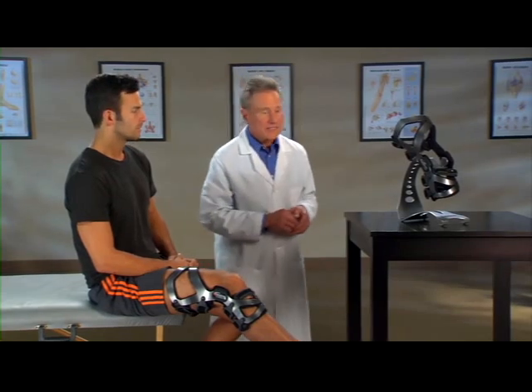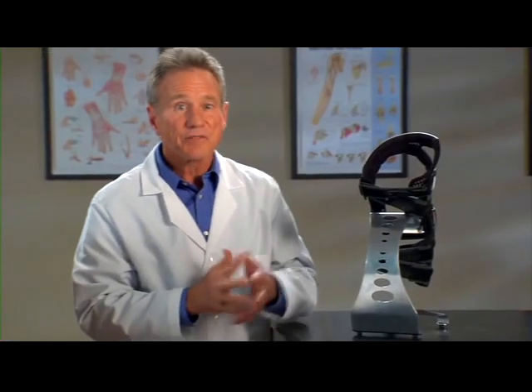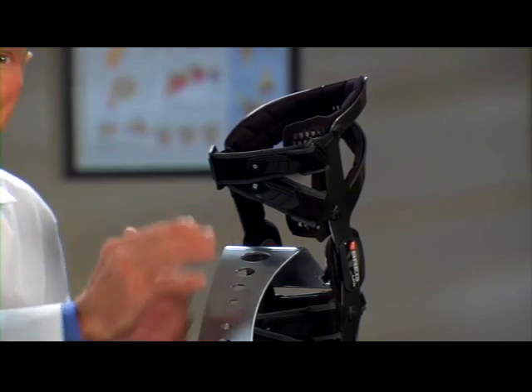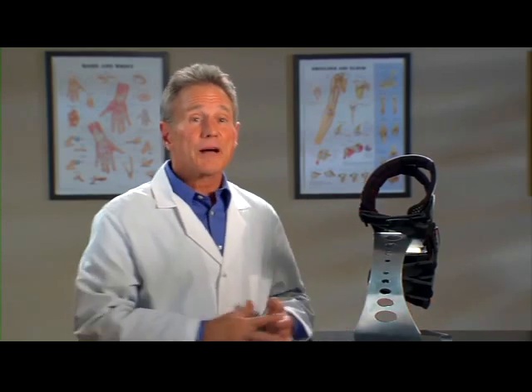Now, look at this. See how the straps are crossed at the back of the knee, opening up this space here? Not only does this simplify strapping and make the brace easier to put on, but it was also designed to keep the back of the knee clear. A lot of braces have straps or other elements that press on this area, making it difficult to get a deep bend at the knee — that can be a problem in many sports and activities. The LPR is different: there's nothing on the brace that puts pressure on this area, making it more comfortable without hindering motion, particularly in deep knee flexion.